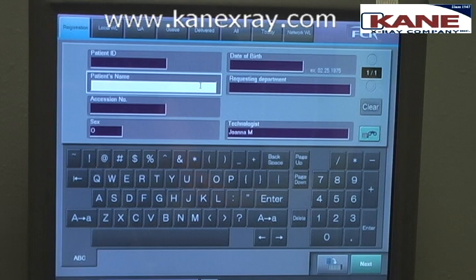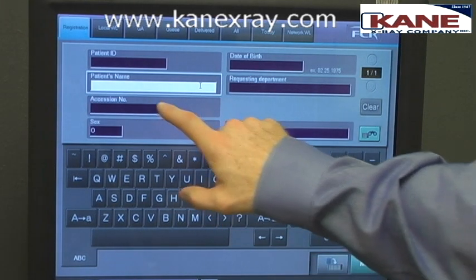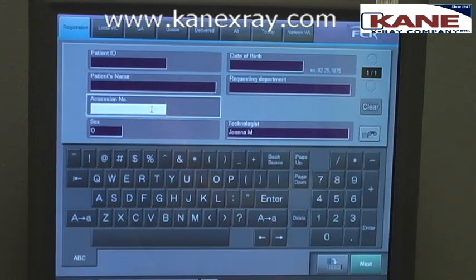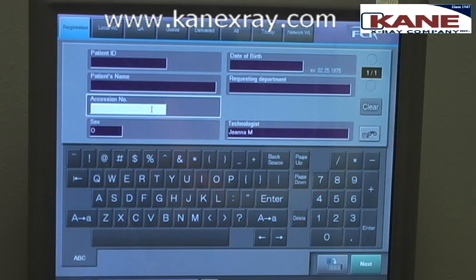Under patient name, we're going to put the owner last name, space, and then the pet name or patient name. Accession number is generally left blank unless we want another unique identifier — either an OFA number or microchip number — to identify that image.